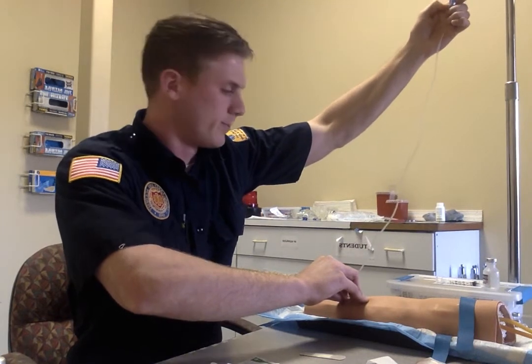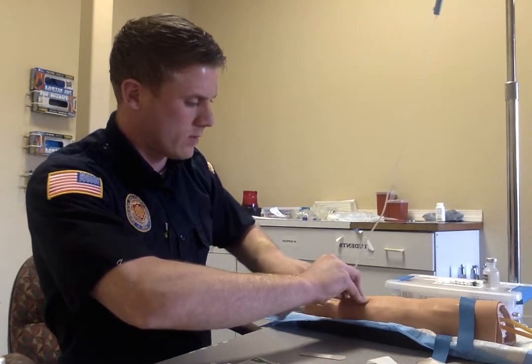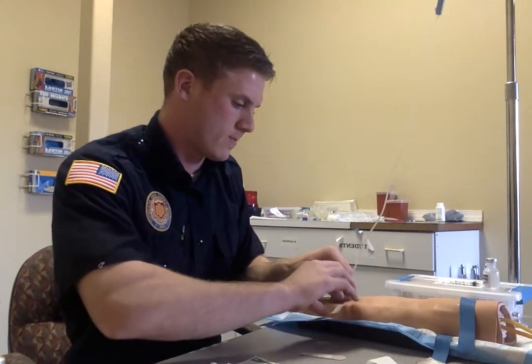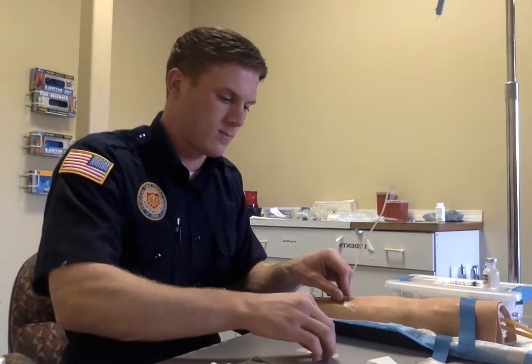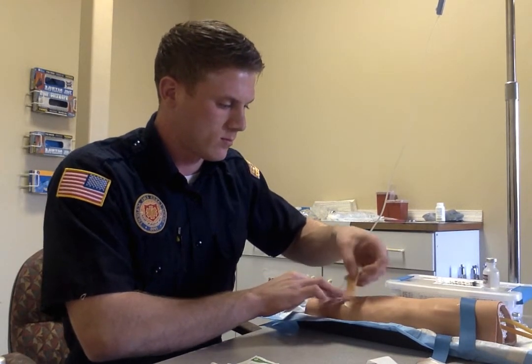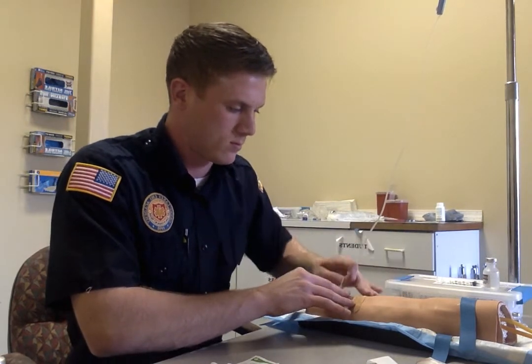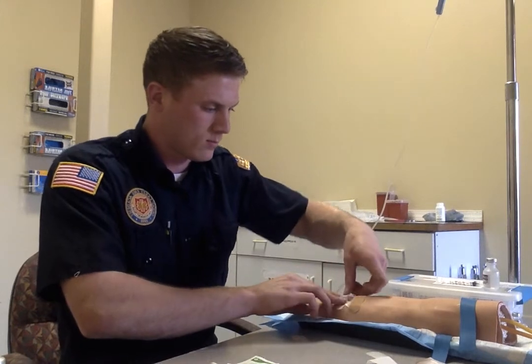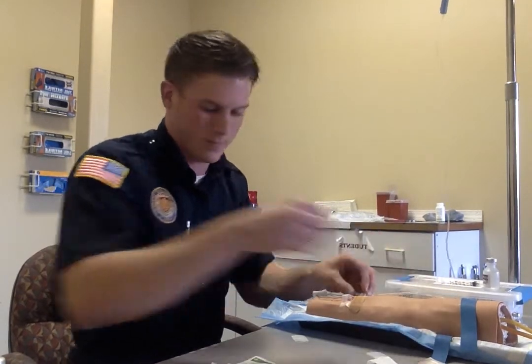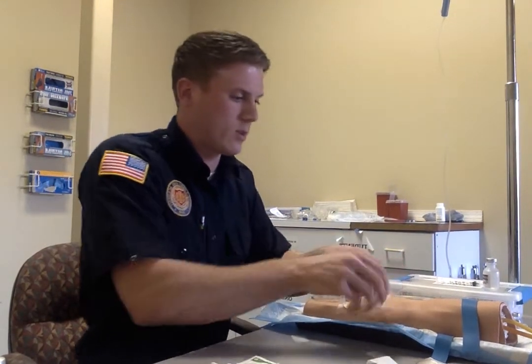That line is running well. So now we'll just secure our IV down and then we can finish up the drip side. And then our IV is secured.